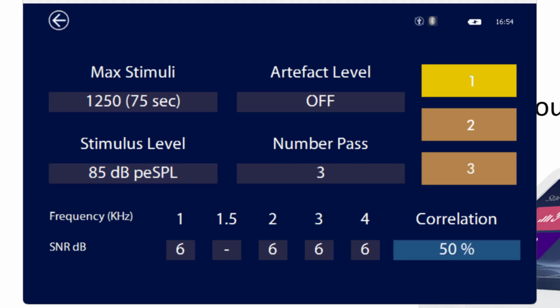As soon as you put in a number there, the pass criteria also needs to match at least the correlation that is shown here. And for an easy demo, I didn't need it in my demo, but if it's a little bit more noisy, it's easier to demo it when it's switched off. If a user wants to have it at some number when they do a screening, that's up to them, in my opinion.